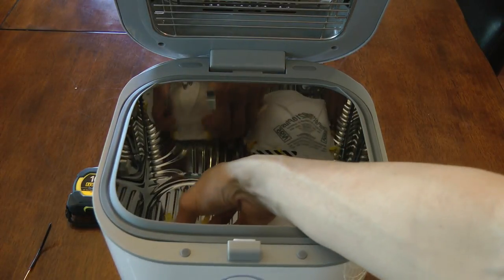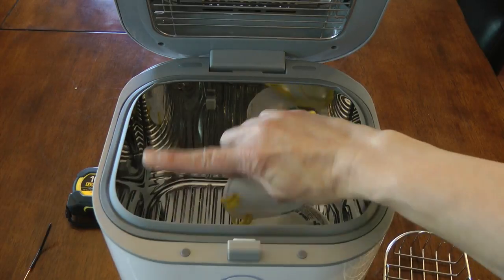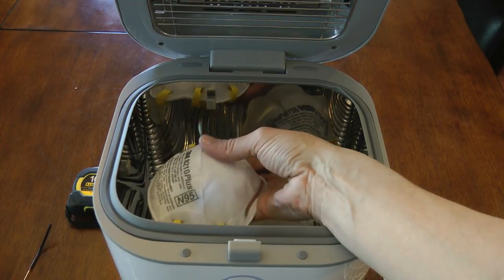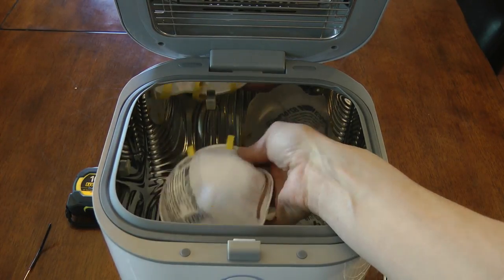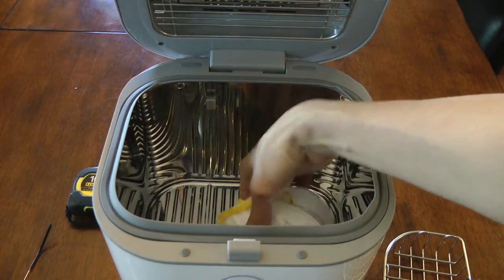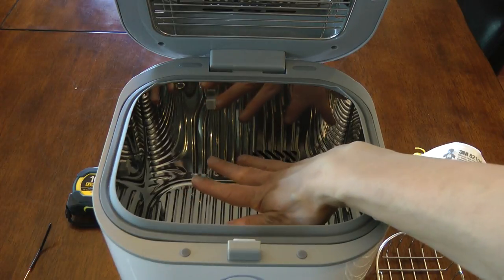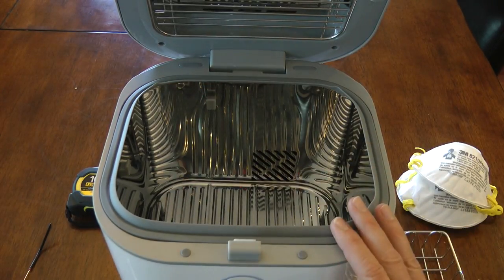What we want is some way to elevate the mask so they sit just below the level of the top of the chamber. That way when we close it, the bulbs will be very close to the surface of the mask and will help disinfect them that much better. There are a number of ways you could do it, but you really don't want to just set something in the bottom because it prevents the light from reflecting around, which is what you really want.